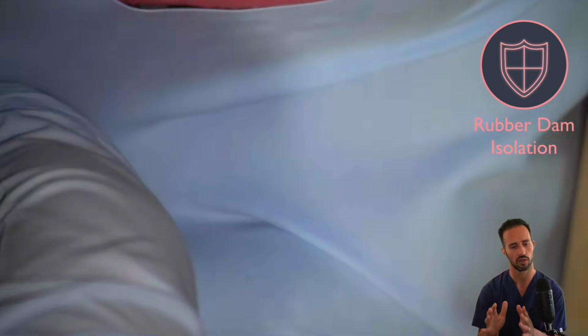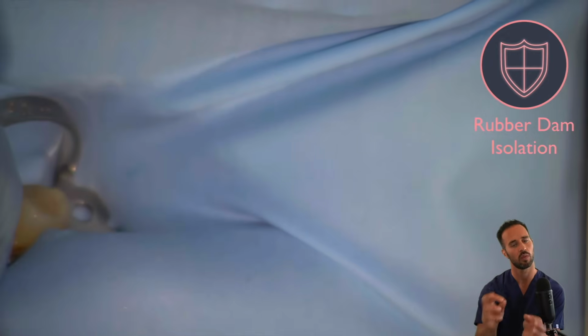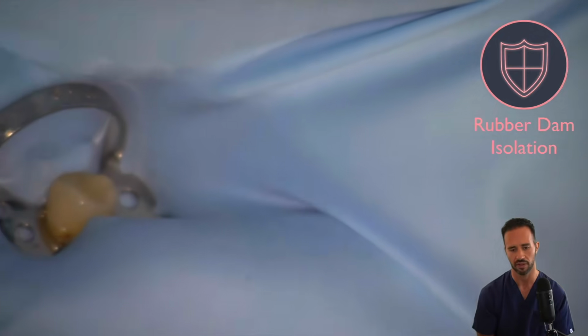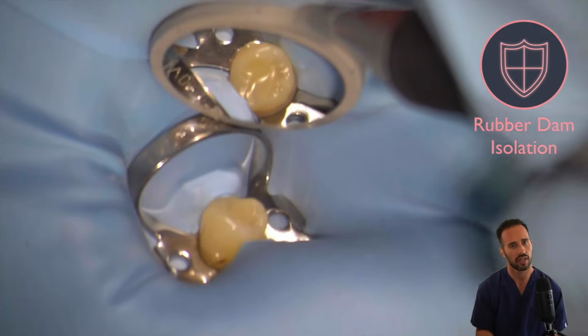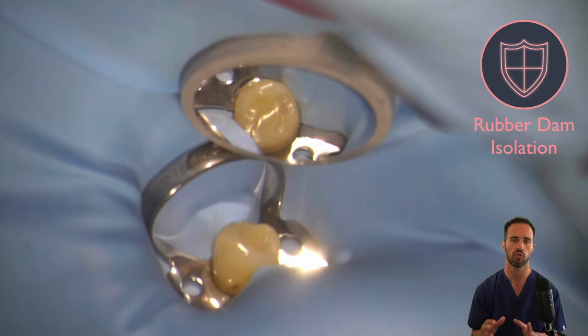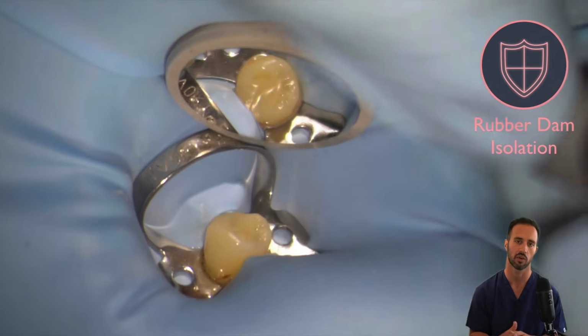That's our universal premolar clamp. And you can see I'm just removing the rubber dam off of the wings with my finger very easily. And when you're doing root canal treatment in general, it's a great idea to lower the occlusion on the teeth that you're working on.